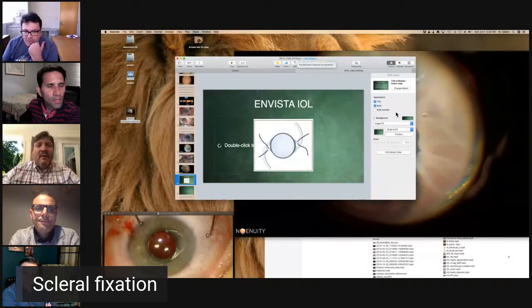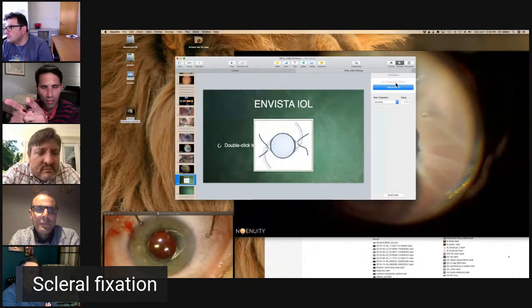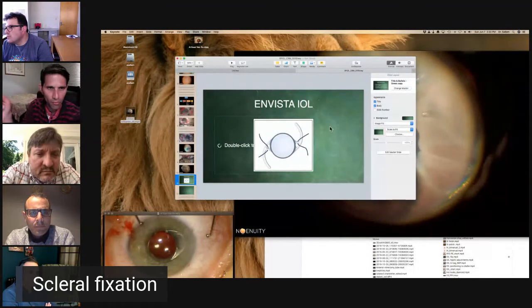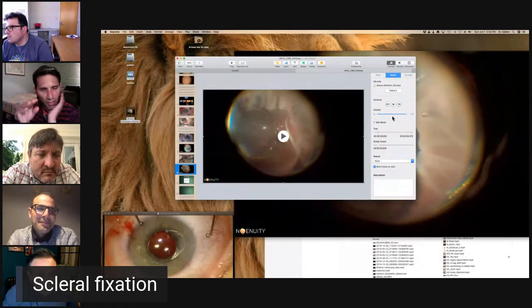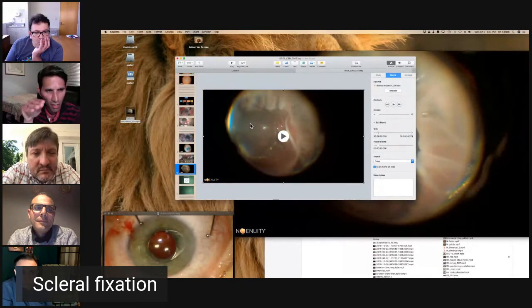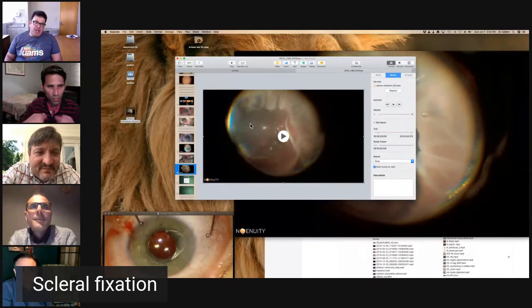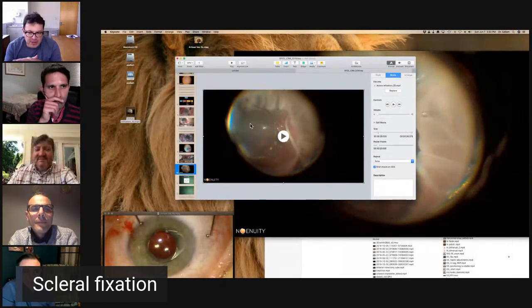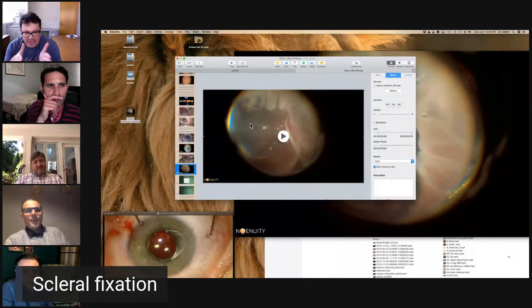Ahmed, what I tend to do when I fold it is I tend to just put the inferior Gore-Tex loops out through the sclerotomies and leave the proximal two not through the sclerotomies, because I just feel that when you fold it and they're all hanging out the eye, and you've got a folded IOL and you're putting it in, there's a lot of thread there to get lost in, and it's all tangled up. And if they get tangled up and then you pull, I just feel having 2 out the eye and 2. I agree, and I used to do this, but until I figured out that if you redo it this way, you will never get a spaghetti if you're always outside your first suture on that side.